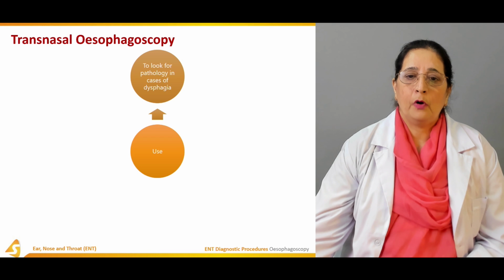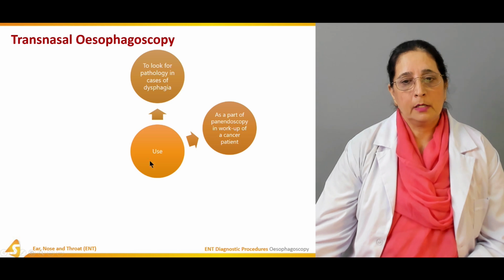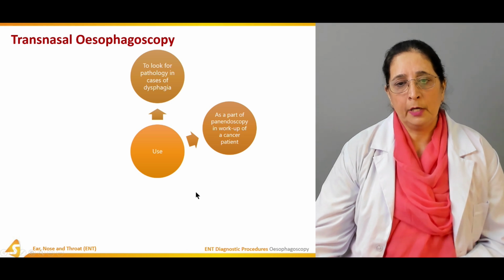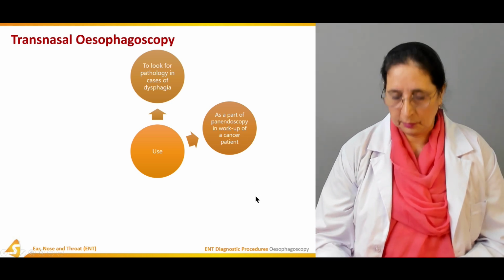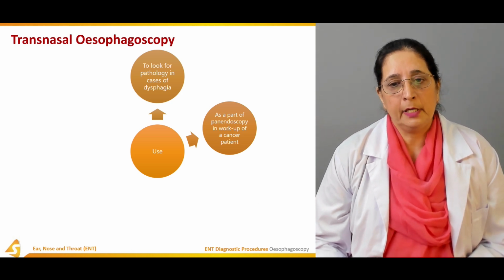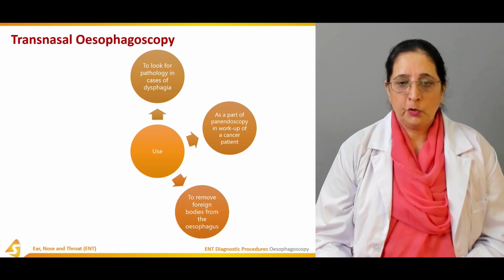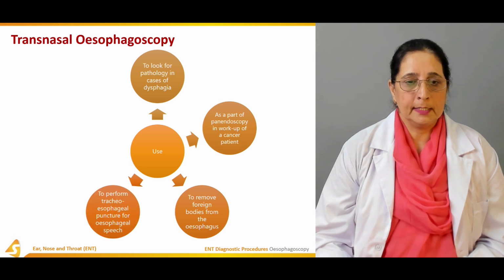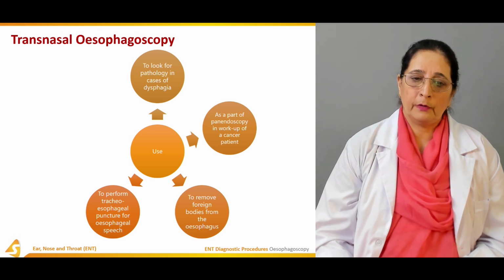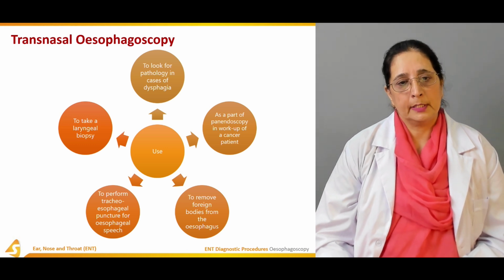Use is to look for pathology in case of dysphagia, as a part of panendoscopy in the workup of a cancer patient, to remove a foreign body from the esophagus, to perform tracheoesophageal puncture for esophageal speech, and to take a laryngeal biopsy.